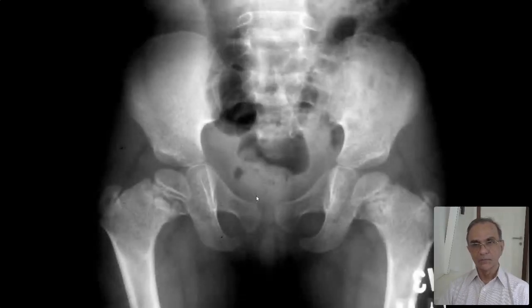Now, look at the two femurs. The first thing that strikes you is the neck of the femur does not show normal tubulation. This is what I meant. One look at it and you know that this is skeletal dysplasia. Besides, it's symmetrical. I didn't say bilateral symmetrical, just symmetrical. So there's non-tubulation of the neck of the femur, and you know that this is skeletal dysplasia. Non-tubulation is a developmental abnormality, so it has to be a dysplasia. Okay, you can't miss this.